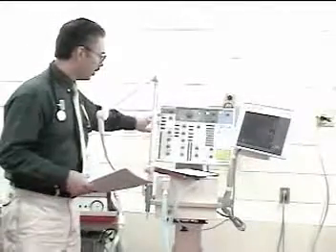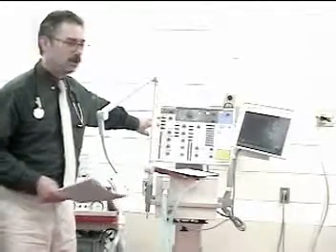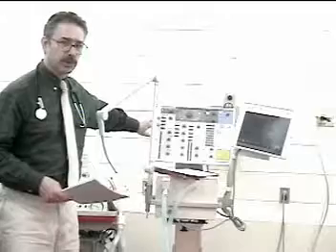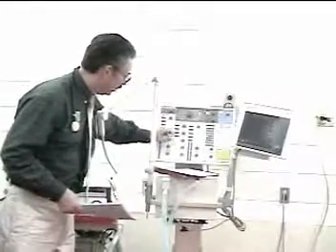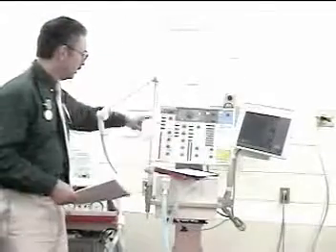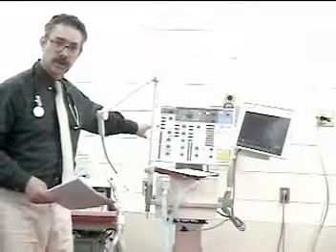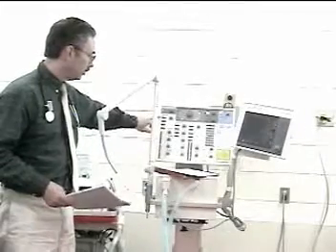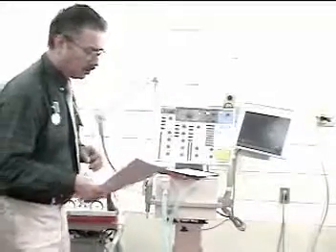For pause pressure: when peak pressure and pause pressure read the same, you are not actually measuring pause pressure. To obtain a pause pressure reading, briefly turn on the pause time to 5 or 10 percent and read the pause value. In this case, peak is 32 and pause is 30. Then turn the pause off, unless it has been specifically ordered.